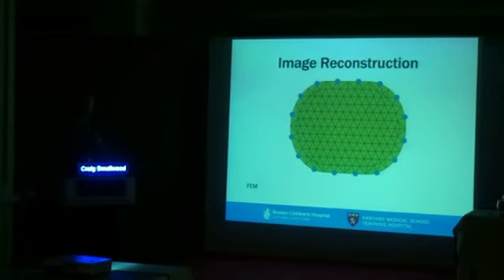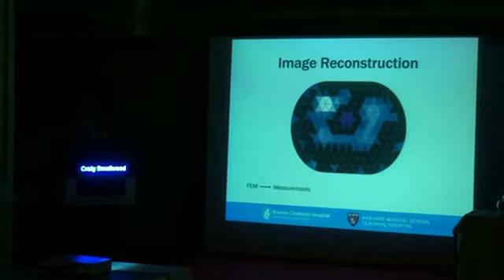That's the finite element. And then we collect all those images, and this is actually the raw data. This is what the data looks like. So we have differences in impedance for each one of these blocks. So the one big difference with EIT compared to a CT image or MRI is the resolution. This is the best resolution. This is the actual true resolution that we're getting. So it's markedly worse compared to MRI or CT, and I think that's one important clinical piece that I'd like you to remember before we go into the workshop this afternoon.